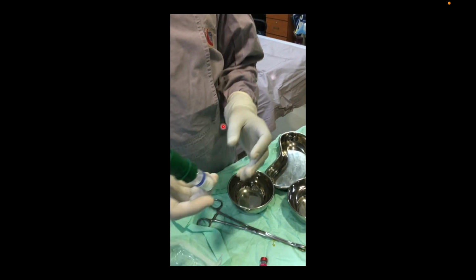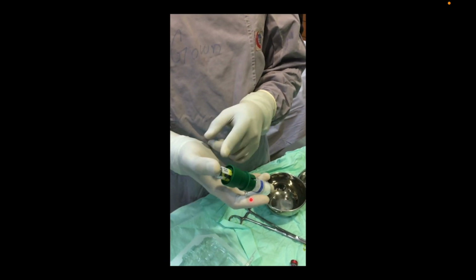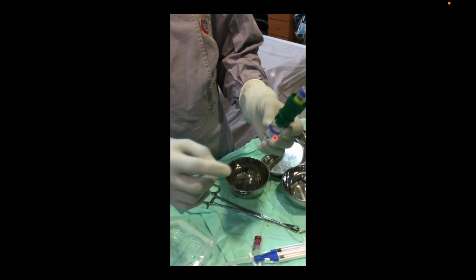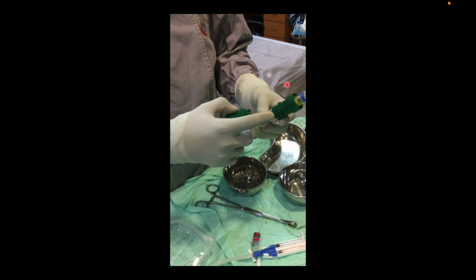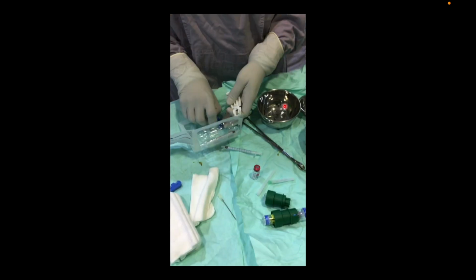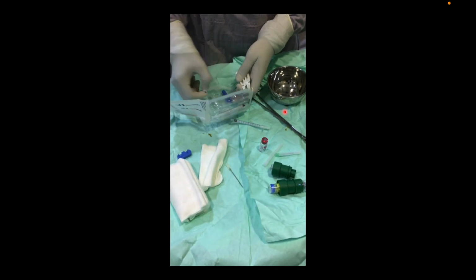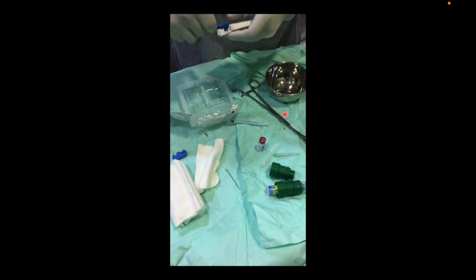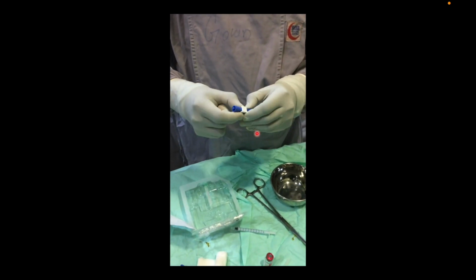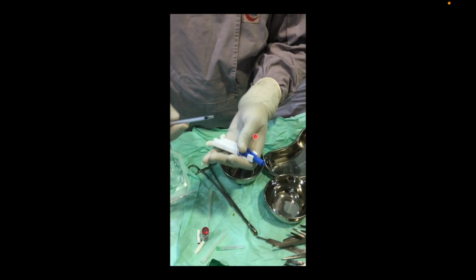Now this is again to show you the same thing. This is fibrin, which we did not use. Again, it has two bottles. One bottle has fibrin powder in it, the other bottle has saline in it, and then you have to press them hard and the saline will start entering into the powder, and once it's mixed, you can draw it. Now there's also this kit that comes with it where you can inject the two together.